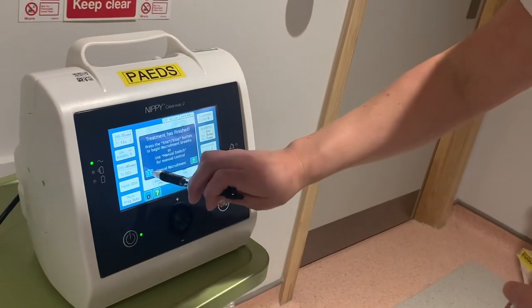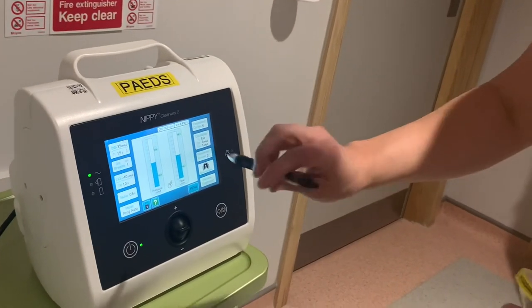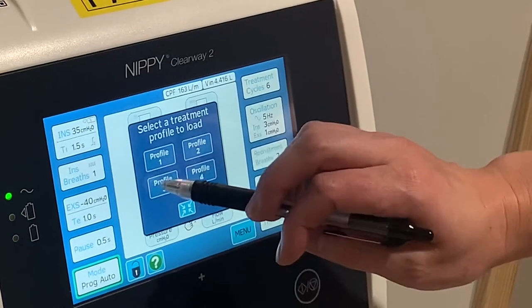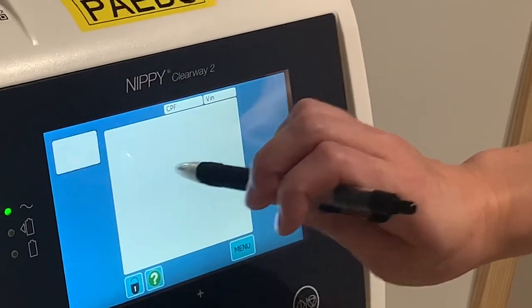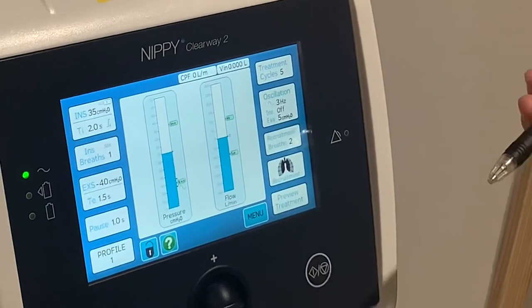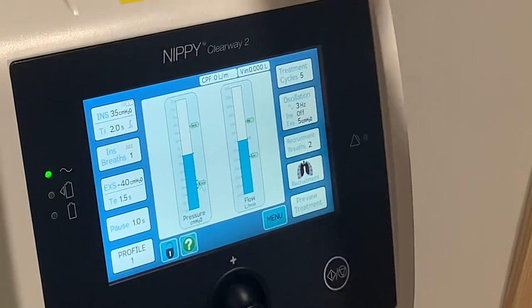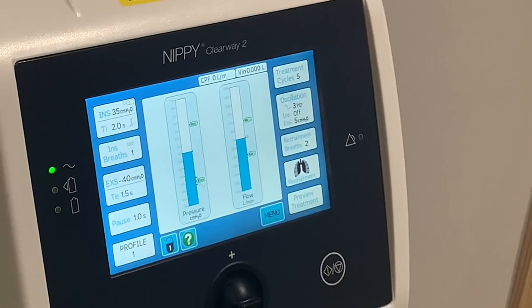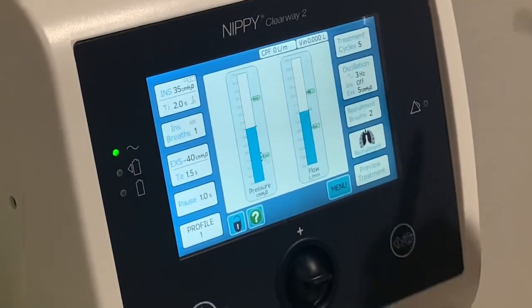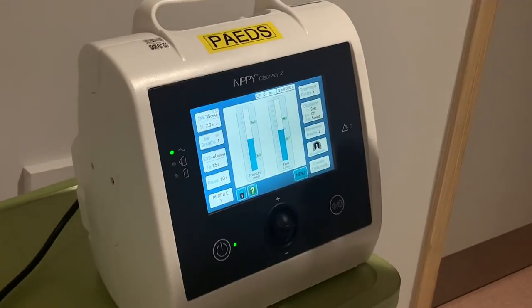On paediatrics, we currently have three patients using the Clearway 2. There's a load profile function — profiles 1 through 4. If I load profile 1, which belongs to one of our current patients, the settings are already loaded and you don't need to change anything. In the notes, I write 'Clearway 2 profile 1' and sometimes add the settings like plus 35, minus 40 afterwards, so staff can go straight to the right profile. Remember, every session still requires the two insufflation breaths after you finish the circuit.